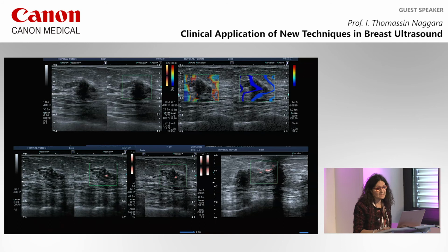It's true that in this type of lesion, spiculated lesion, you can finally have a negative SMI, but the combination of elastography and SMI helps you to detect everything, because the stiff lesion, which can be spiculated like luminal A breast cancer, is usually malignant on elastography and probably less vascular on SMI, but the lesions that are false negative on elastography, especially the lesions that are triple negative, will have high vascularization.